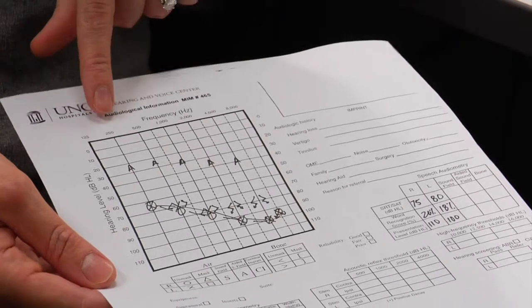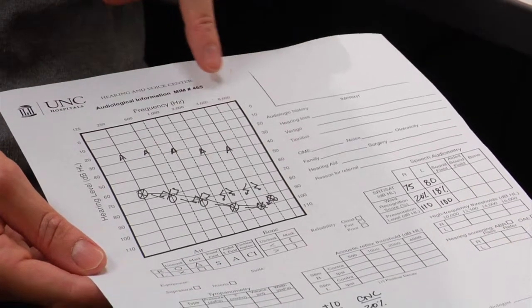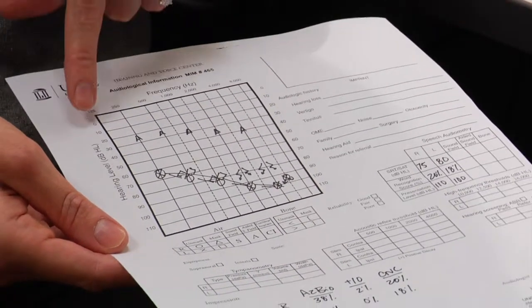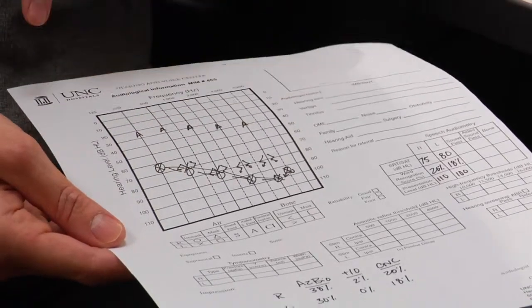At the top of the audiogram, we have the frequency range going from low frequencies to high frequencies. On the side, we have volume, so we go from soft sounds all the way down to louder sounds at the bottom.